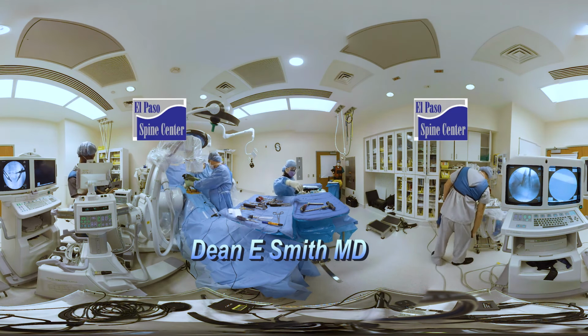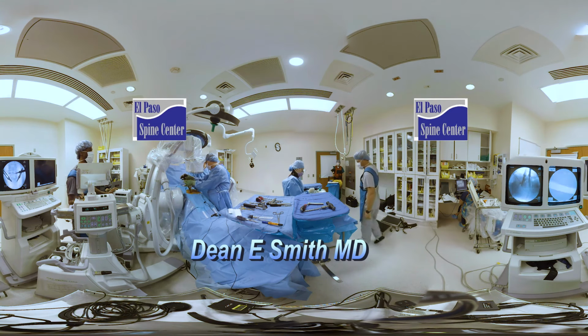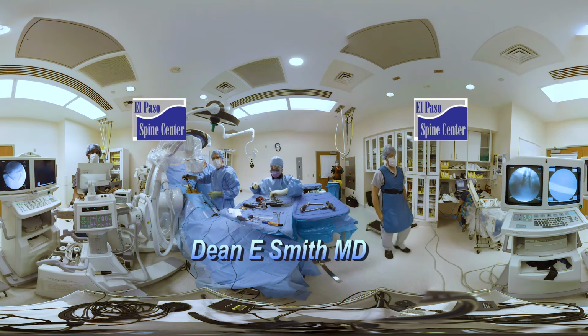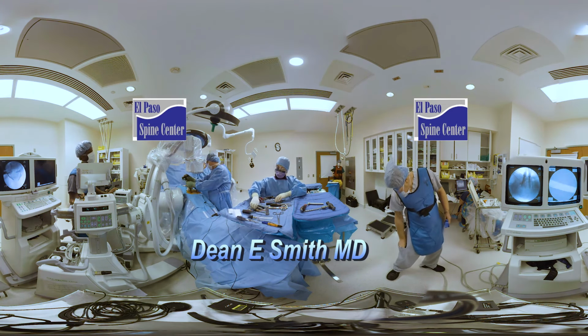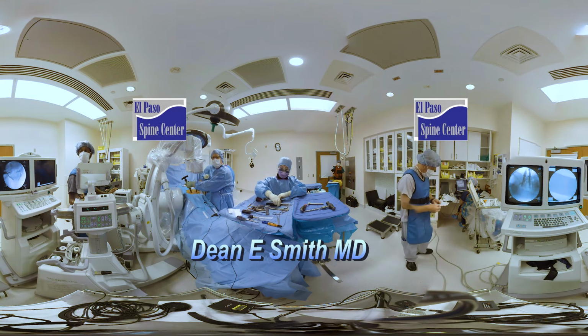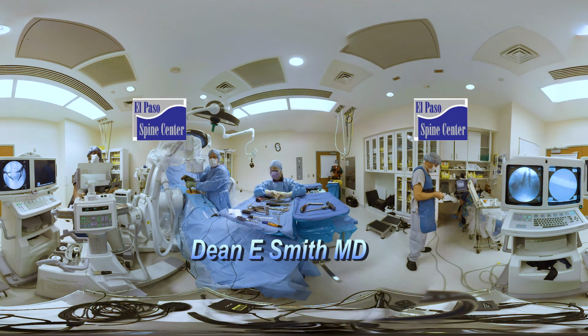Yeah, really, when that gets to the skin, that's the main thing. I'm lined up. Lateral. Okay, that's kind of lined up right there. Okay, that looks good. Lateral. AP. I like it. I would venture to say it's probably the best ever done.